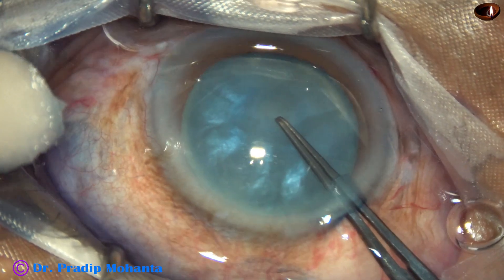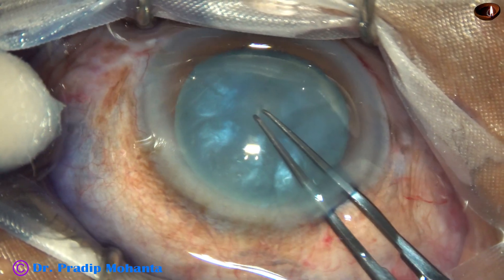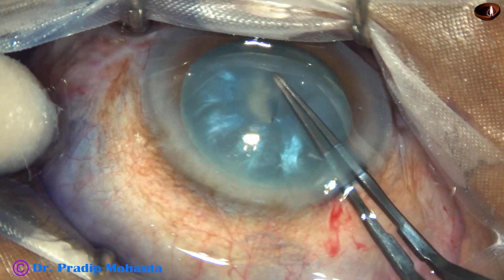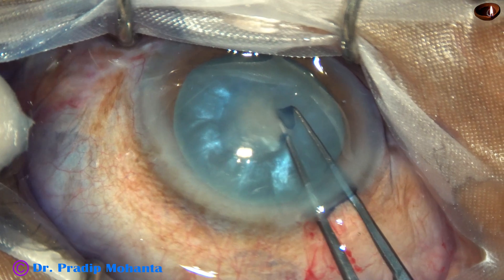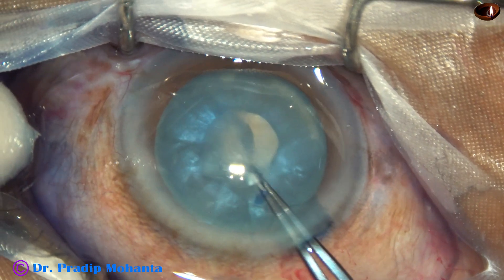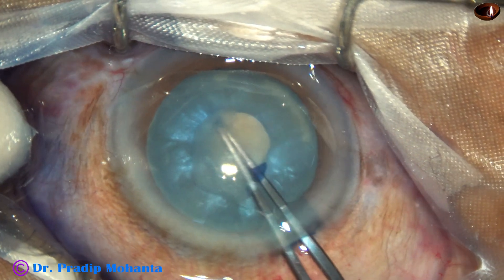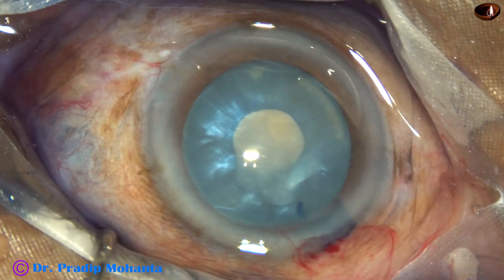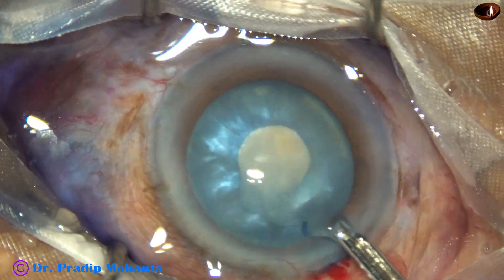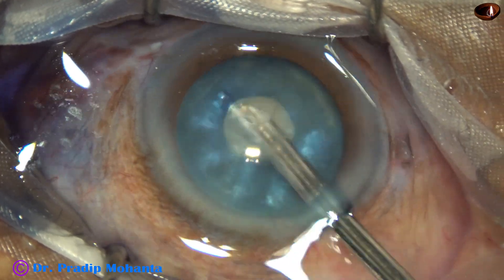I go with the utrata forceps, make a small puncture in the anterior capsule at the central part, hold the capsular tag, and do a small rhexis at this moment.